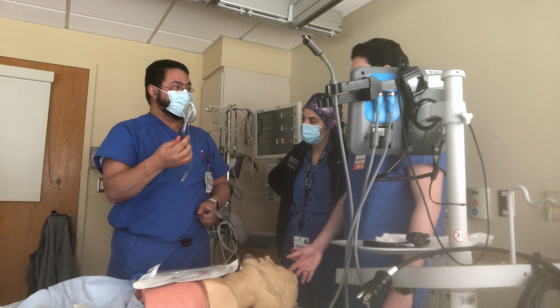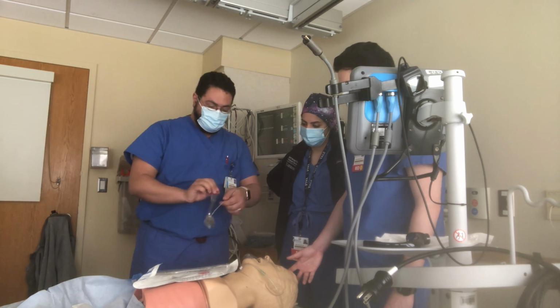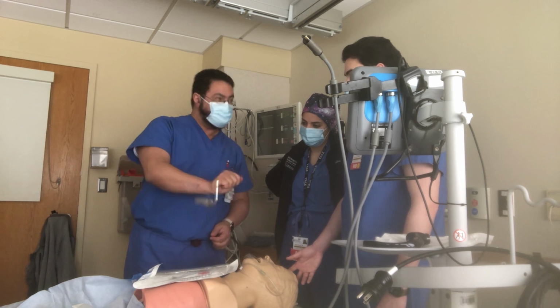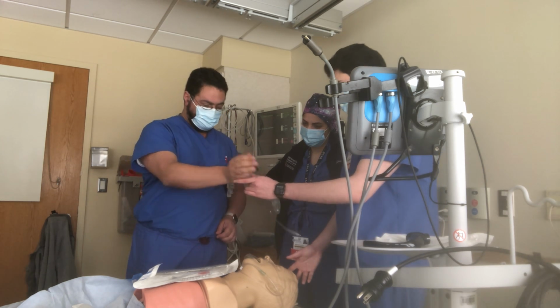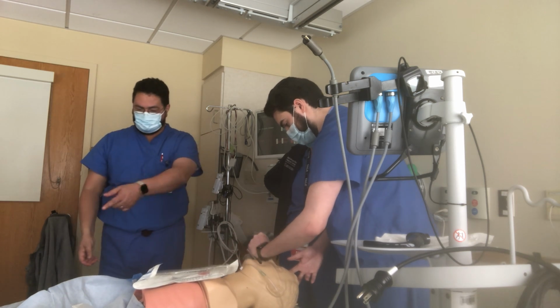It was invented by somebody called Dr. Brain. His name is Brain, actually. Anyway, so this one here, you don't put anything inside the patient's mouth. You hold it like this, and you go with the curvature. Very easy, right? So that's an LMA also, but that's why I like this better.